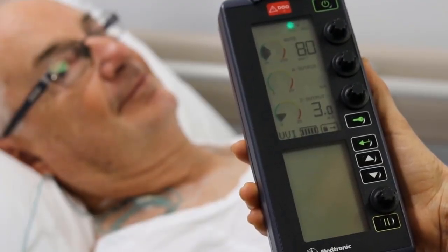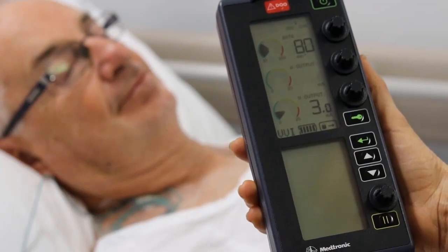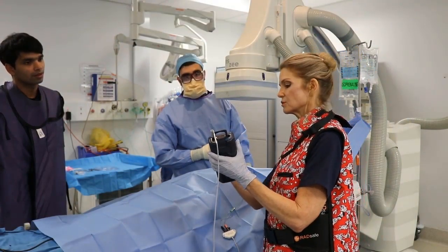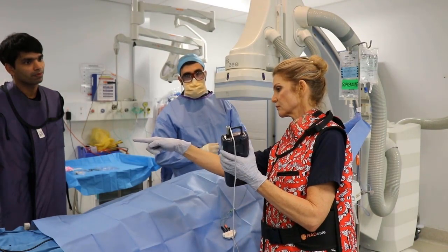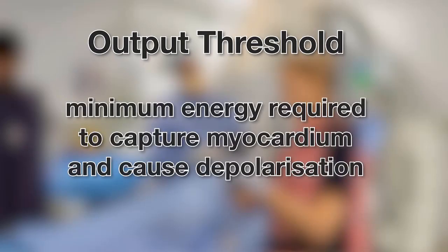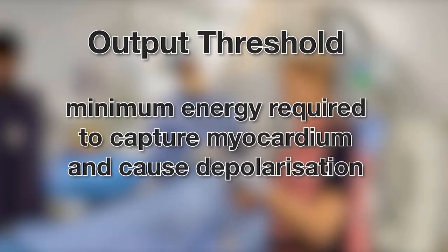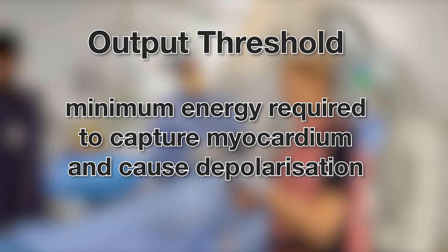Temporary invasive pacing of the myocardium is used for a variety of arrhythmias that cause loss of cardiac output and often is an emergency procedure. The output threshold is the minimum amount of energy required to capture the myocardium and cause depolarisation. To find the output threshold, follow the steps outlined in this video.